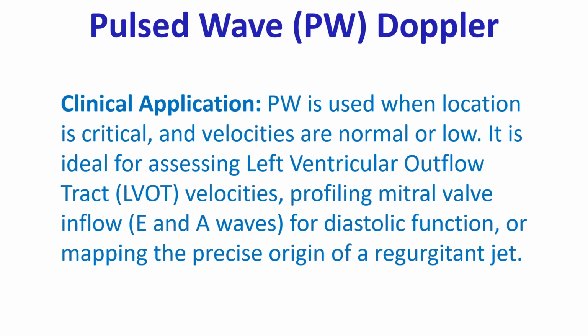Clinical application. Pulsed wave is used when location is critical and velocities are normal or low. It is ideal for assessing left ventricular outflow tract velocities, profiling mitral valve inflow E and A waves for diastolic function, or mapping the precise origin of a regurgitant jet.